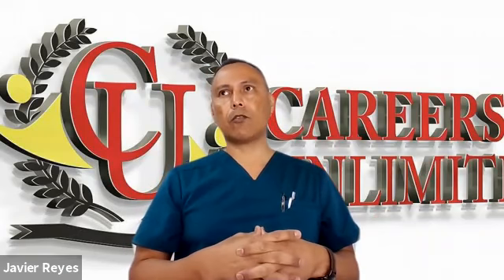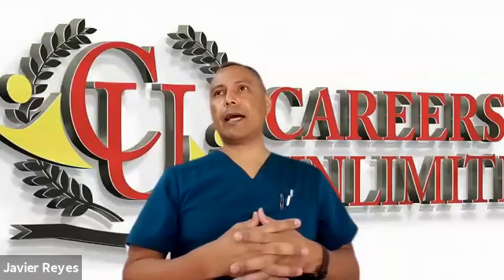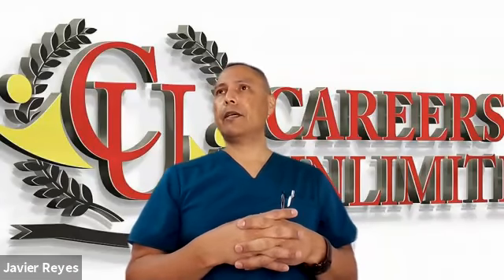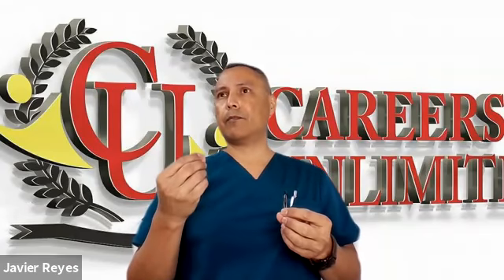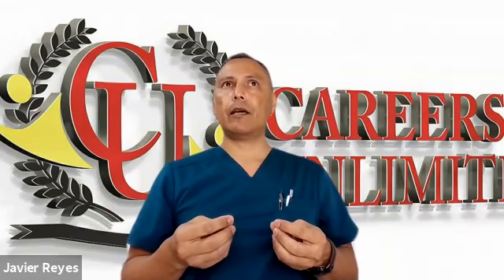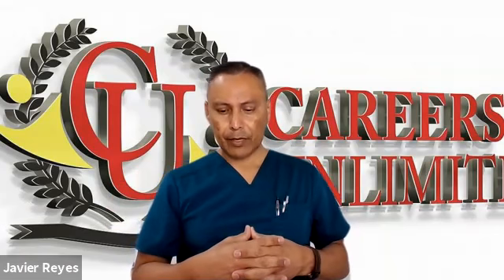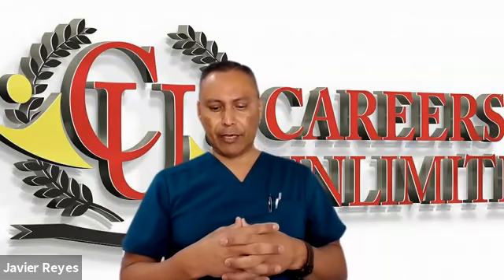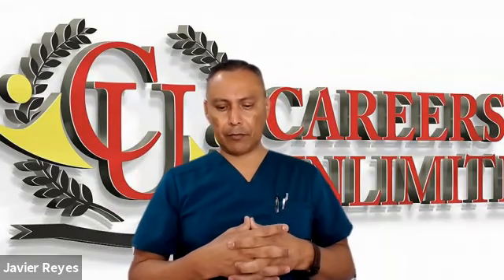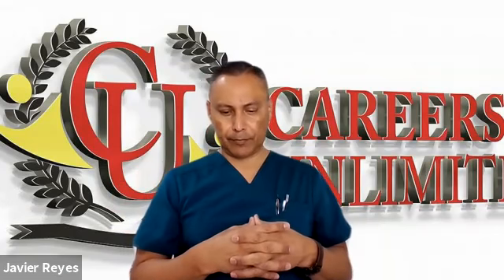Of course, these are not normal. Now, this may be something that the person has a history of. Maybe they have had a heart attack, which damaged the branch, the right or the left. So you'll see an abnormal EKG on a person. The patient may be experiencing sinus rhythm with a left bundle branch block. The basic rhythm and underlying rhythm must always be determined and specified along with right or left bundle branch block.